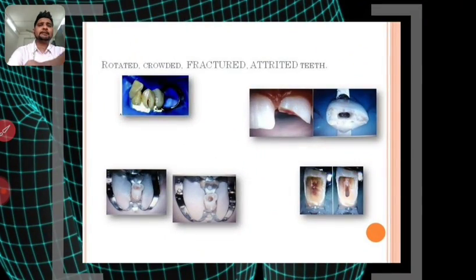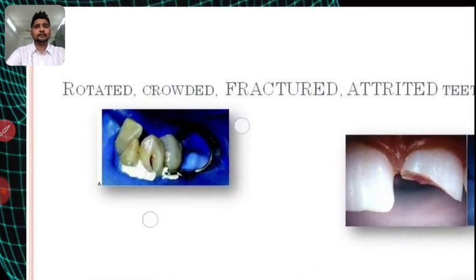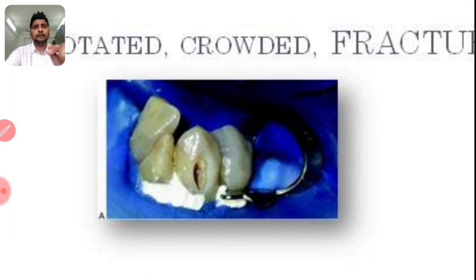So there's some tips. Sometimes you have rotated teeth, there is no harm in doing a facial opening. Okay, you have crowding, no point. We don't do facial opening only and only because of aesthetics. So if your patient you can manage, they're aesthetically not that demanding, do a facial opening. Don't worry about it. Alright?